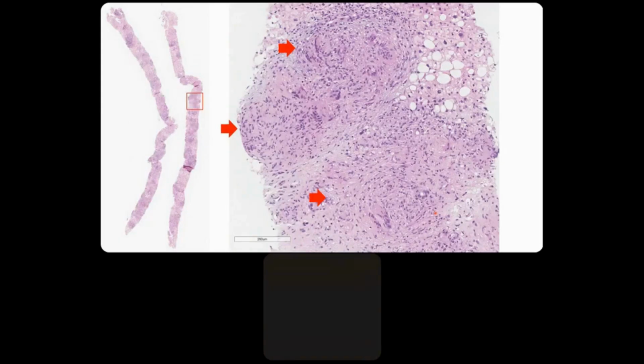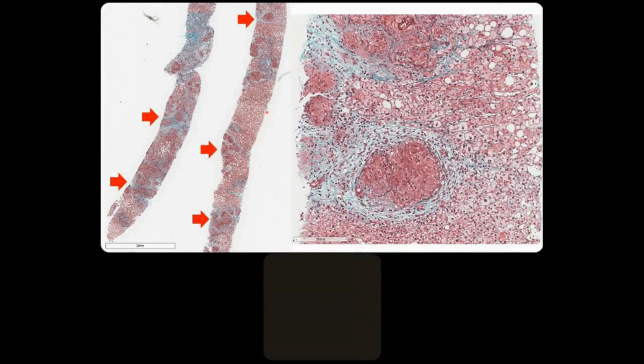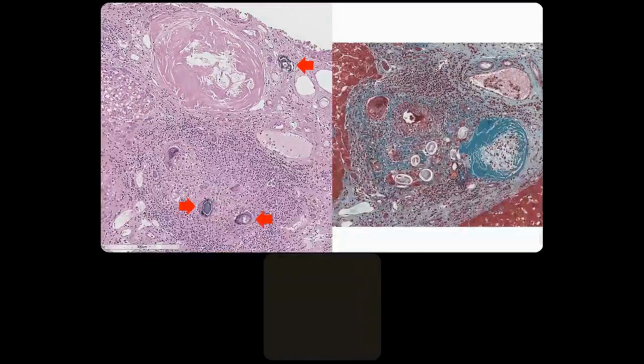Moving on to other examples of infiltrative liver disease. So here is a liver biopsy in a patient with known sarcoidosis. On higher magnification, you can appreciate these very nicely formed non-necrotizing epithelioid granulomas, which are consistent in this clinical context with liver involvement by sarcoidosis. Here is the corresponding trichrome stain showing significant hepatic fibrosis, which can occur in association with chronic granulomatous inflammation.